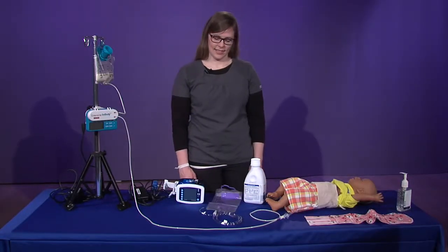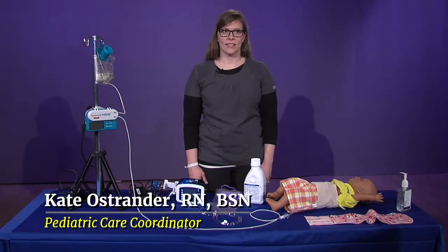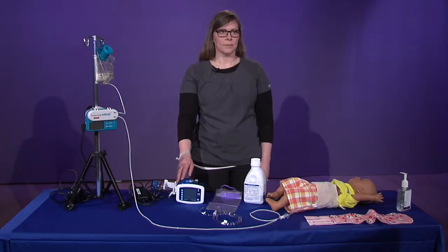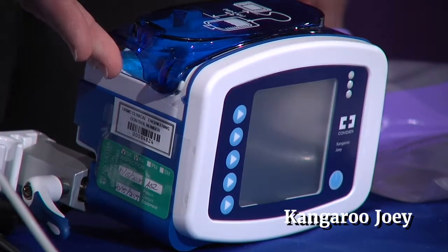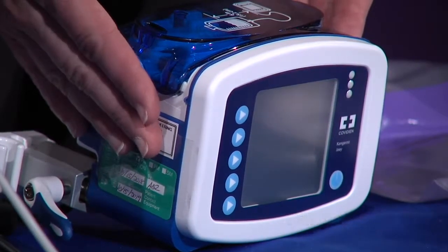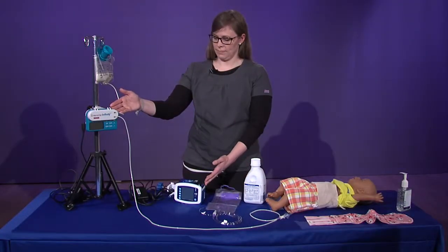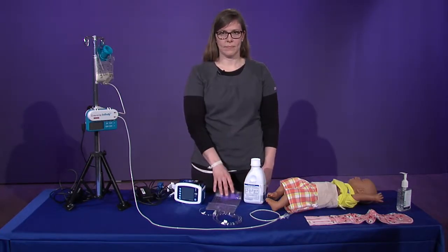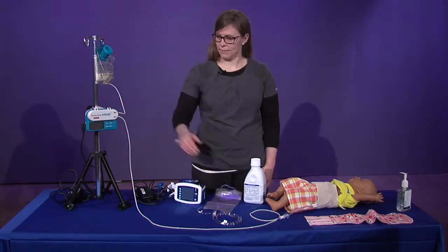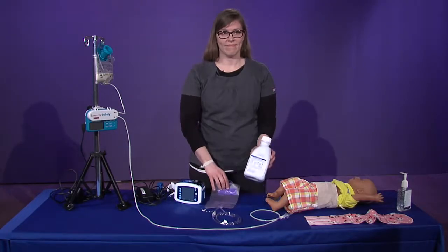You will learn the specifics about how to set up your home feeding pump from your vendor that will provide your child's pump and feeding supplies. These are two of the most commonly used home feeding pumps, the Kangaroo Joey and the Infinity. Both pumps are relatively small and portable. They come with a battery and a bag or a backpack. Other equipment you will receive include an IV pole, feeding bags, and what your child is being fed through the tube.